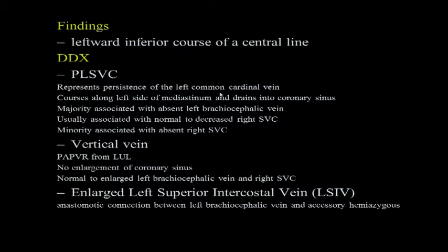Who can tell me what a left superior intercostal vein looks like on a chest X-ray? I will take that person for coffee. It has a very classic appearance on chest X-ray. I can't hear. You see that on chest X-ray and say, hey, this is a left superior intercostal vein. Anyone? I cannot hear. Did you say something, Tope or Sylvia? What did you say, Ati? Maybe I'm wrong, but never mind.